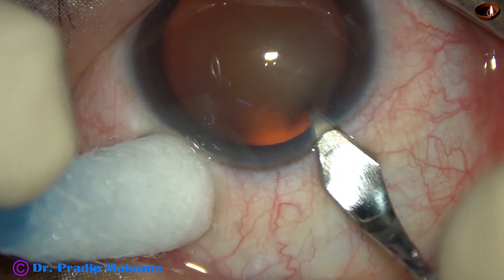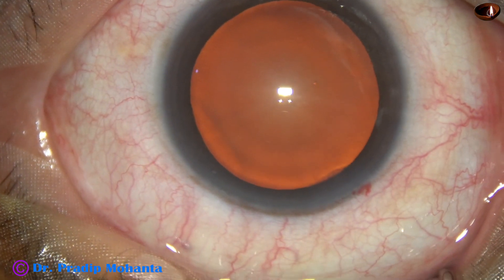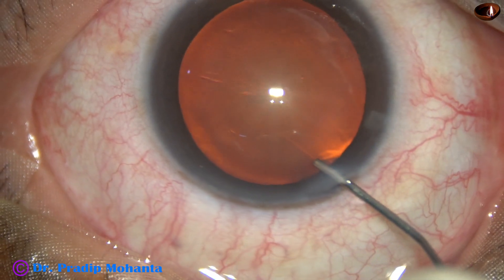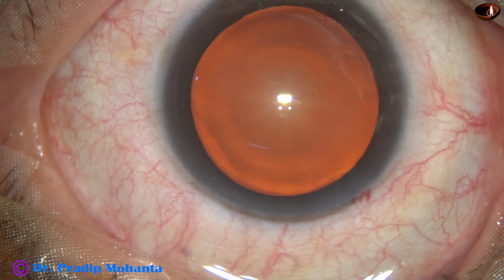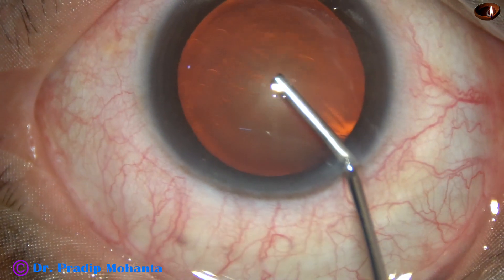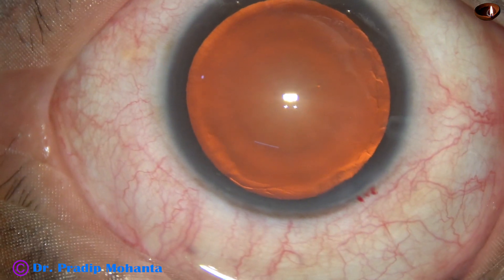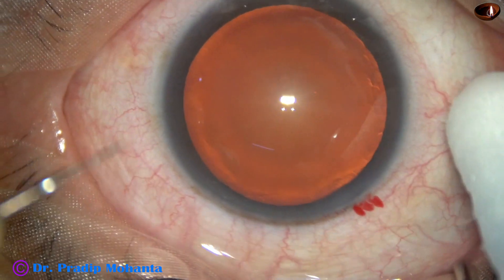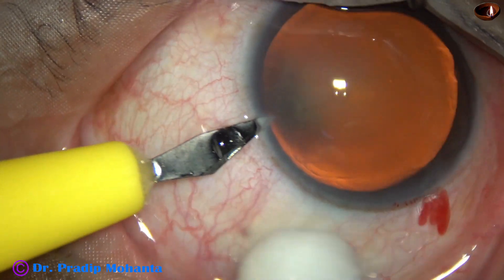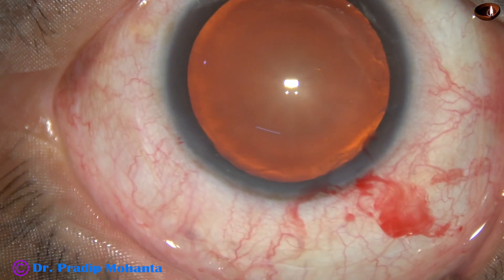This is the main incision with a 2.8 mm steel keratome. This is phenocaine, which contains tropicamide, phenylephrine, and lignocaine. This is 2% hydroxypropylmethylcellulose filling up the anterior chamber. In this case I had very good red glow, so I didn't apply HPMC over the corneal epithelium.